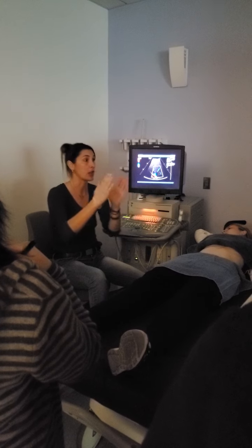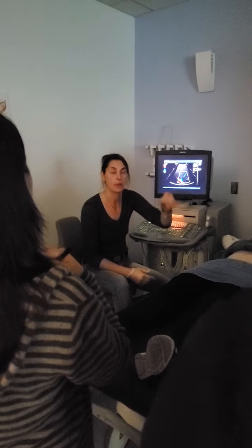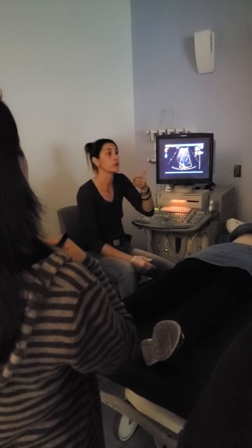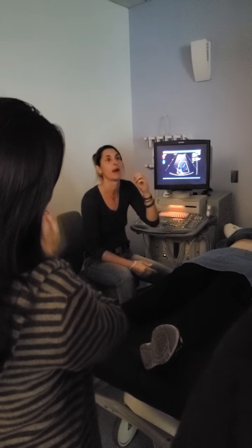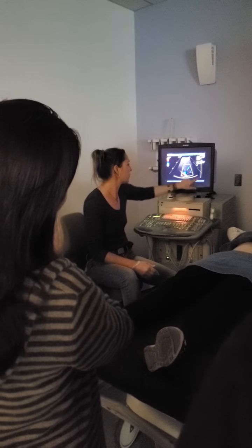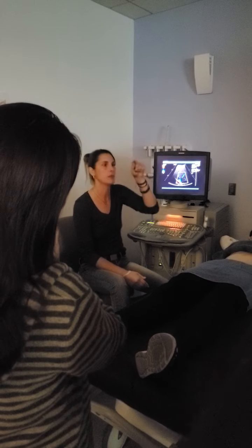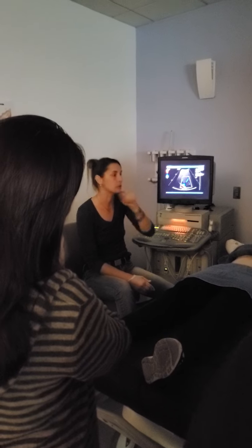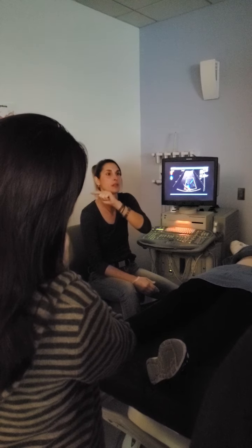So we have this kind of change in pressure gradient. It'll be going forward towards the right atrium, and then when the door shuts, you'll have a little bit of reversal of flow. So it's going to go blue, a little bit of red, blue, a little bit of red. And when we look at the spectral Doppler in a second, it's called the Wonder Woman sign. So it's like down, down, a little bit up, down, down, a little bit up. So we expect blue, blue, a little bit of red, blue, blue, a little bit of red as it goes.